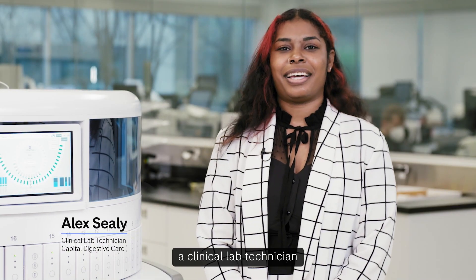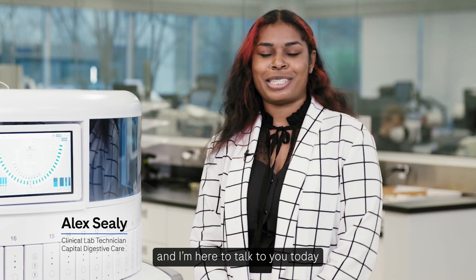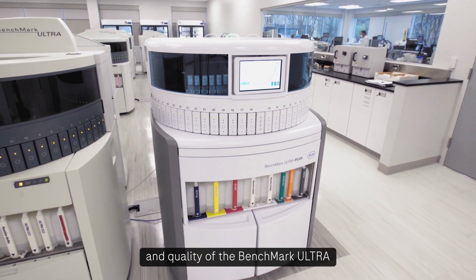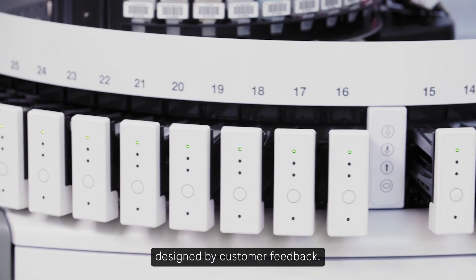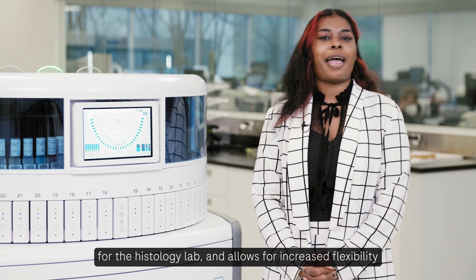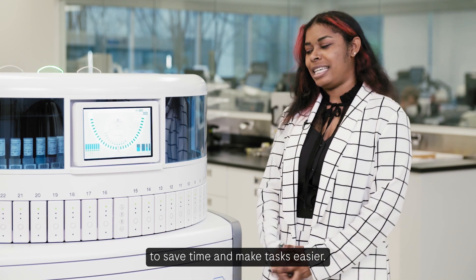Hi, I'm Alex Seeley, a clinical lab technician here at Capital Digestive Care, and I'm here to talk to you today about the Benchmark Ultra Plus. The Benchmark Ultra Plus is built off the foundation and quality of the Benchmark Ultra with added features and functionality designed by customer feedback, optimizing workflow for the histology lab and allowing for increased flexibility to save time and make tasks easier.